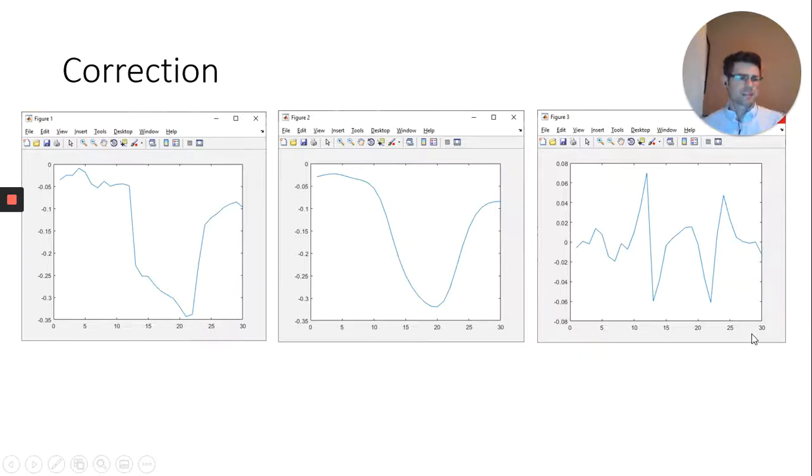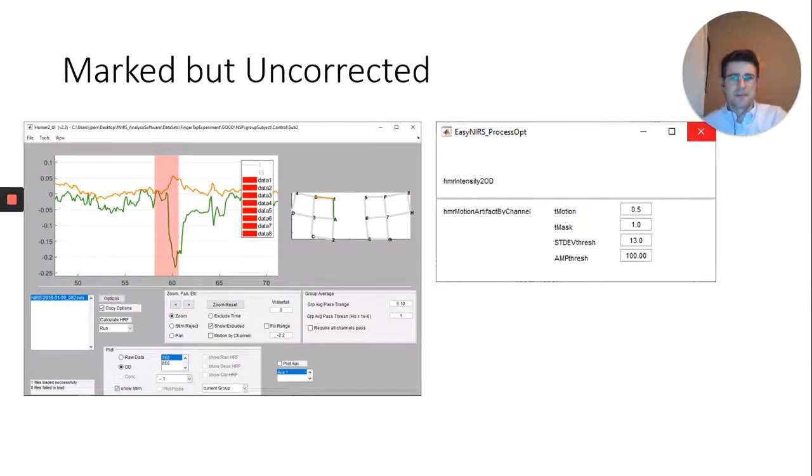Here are basically the residuals. I fit my model to the data, I remove everything that's my model, and I keep the residuals. And you get an output similar to the one on the right. There's a lot of assumptions that go into that, but it's kind of an interesting fix. This is the first step. So that's kind of the overall process. Here's the first step of it.